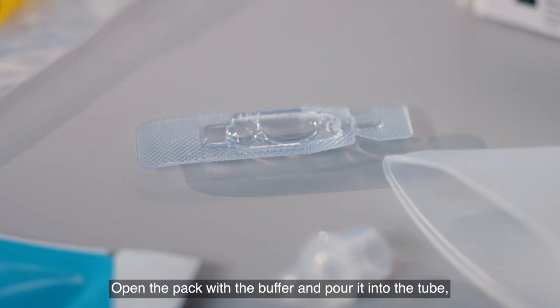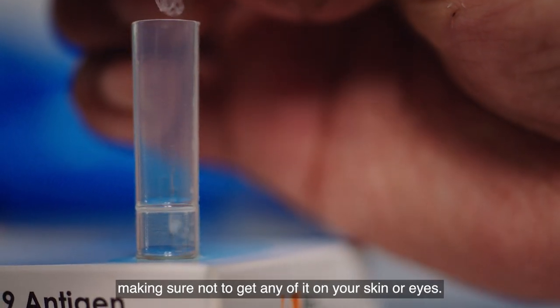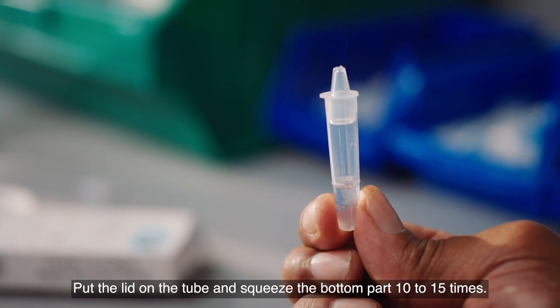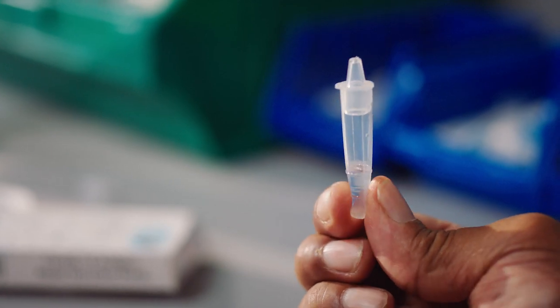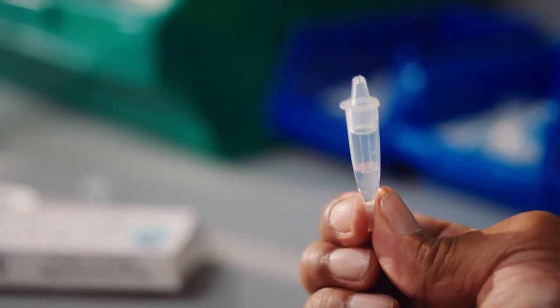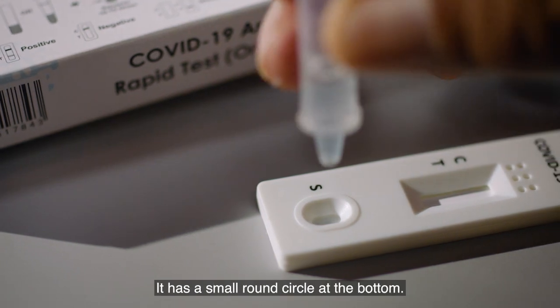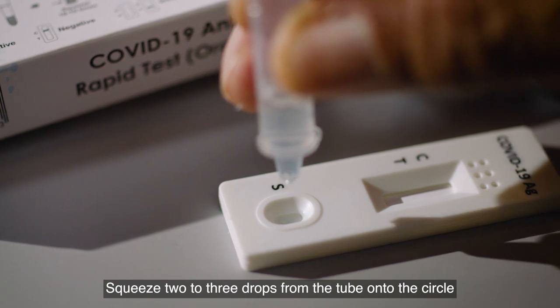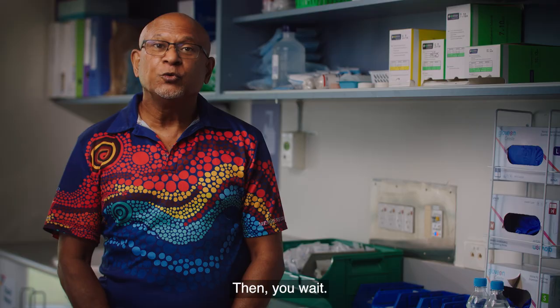Open the pack with the buffer and pour it into the tube, making sure not to get any on your skin or eyes. Put the lid on the tube and squeeze the bottom part 10 to 15 times. Get the strip that will show if you have COVID-19 — it has a small round circle at the bottom. Squeeze two to three drops from the tube into the circle, set your timer for 15 minutes, then you wait.